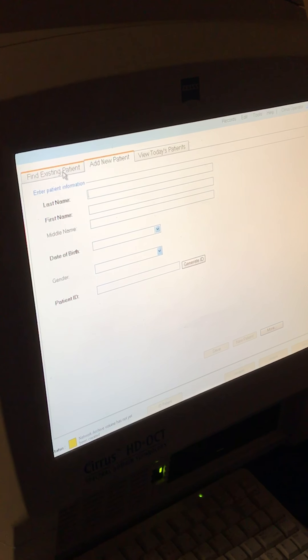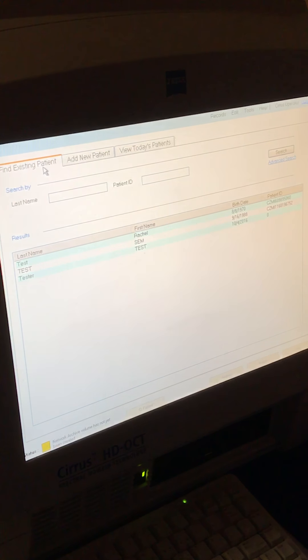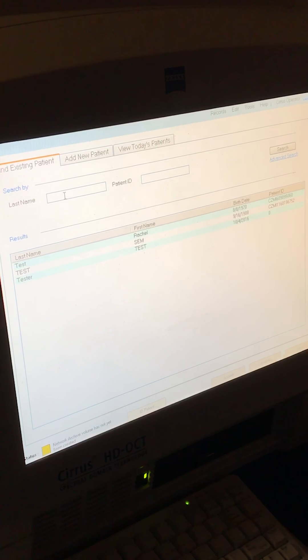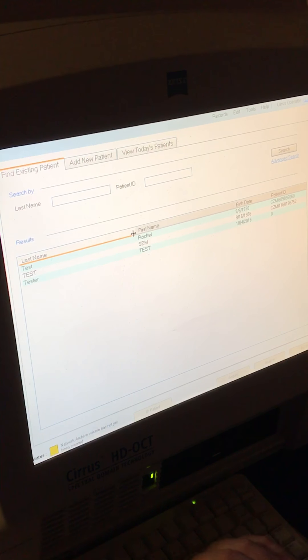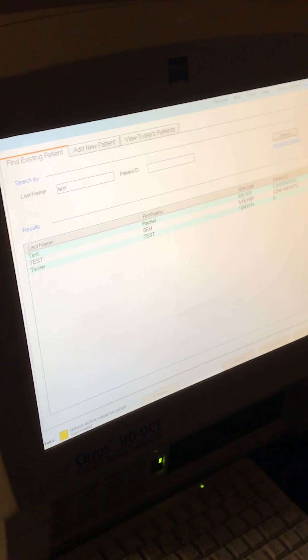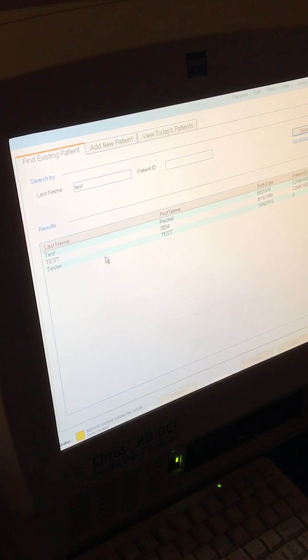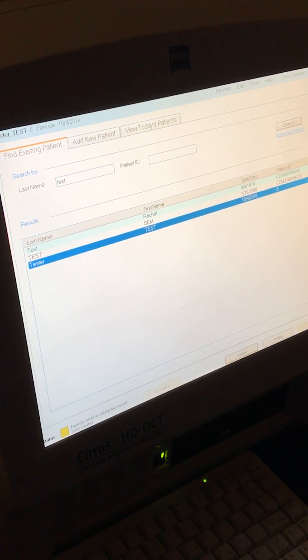If they've been here before, we can go to find existing patient. I'm going to just search for a test patient. Once you find the patient, you'll click on their name and then hit Acquire down below.